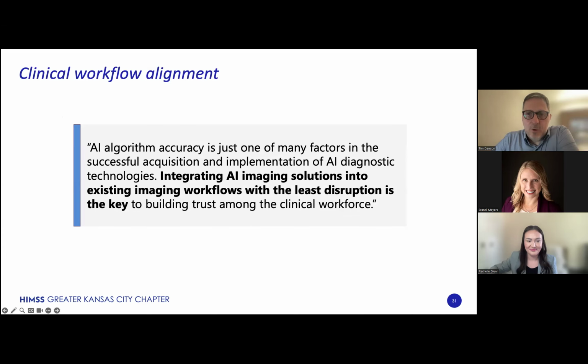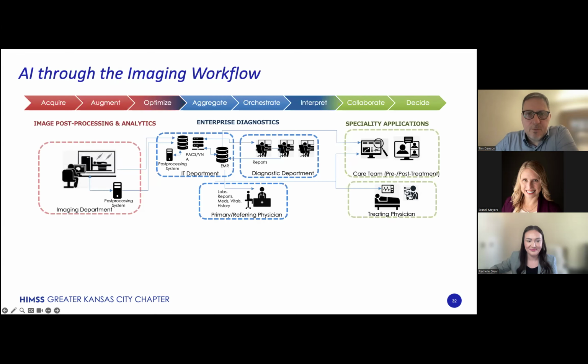In other words, a lot more than just image analysis, but it needs to be integrated into that clinical workflow. So we really need to walk through the typical imaging workflow and see how AI can help, because we really need to minimize disruption.